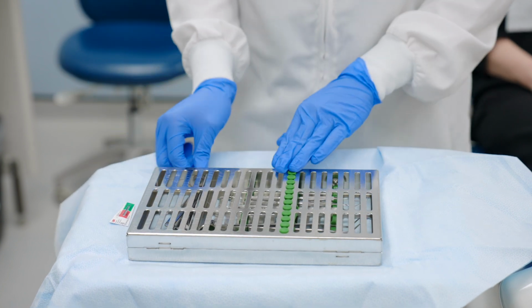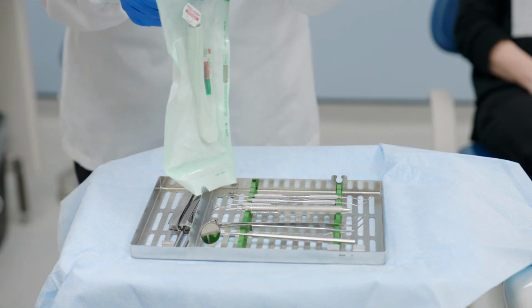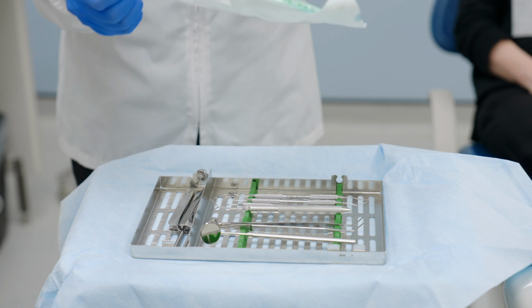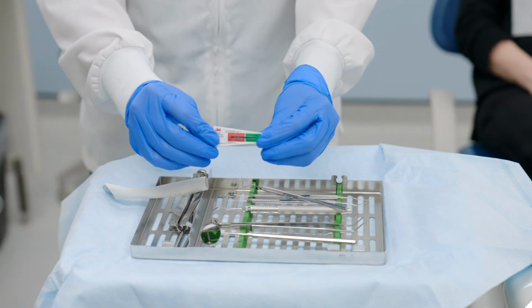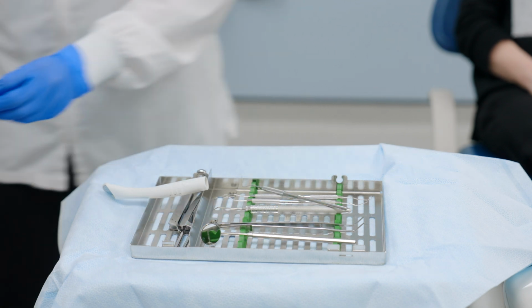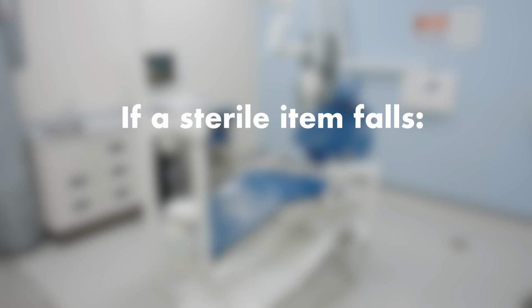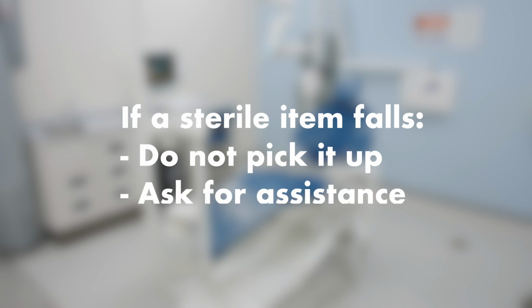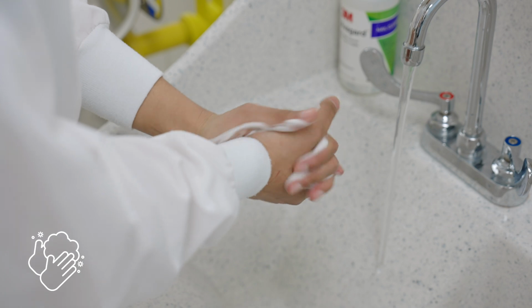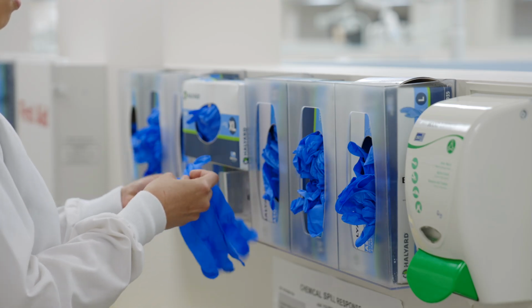get another tray. When opening a steri peel pouch, perform a visual inspection for debris, rips, tears, or moisture. If the package has not been compromised, open the pouch from the base, making sure that the chemical integrator is present and has passed. During treatment, if a sterile item falls on the floor, do not pick it up until the procedure is finished. Ask for assistance for the retrieval of a sterile replacement. Be sure to perform hand hygiene and don a clean pair of gloves before resuming patient treatment.